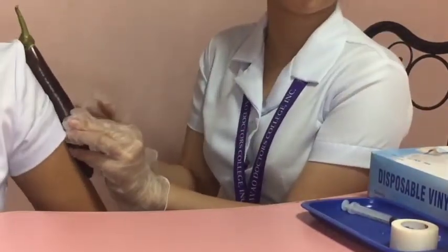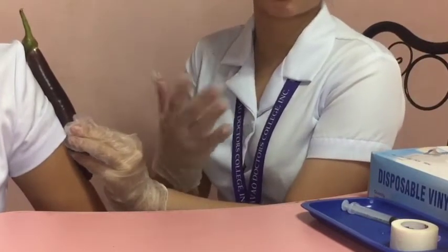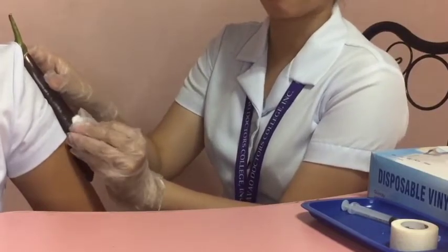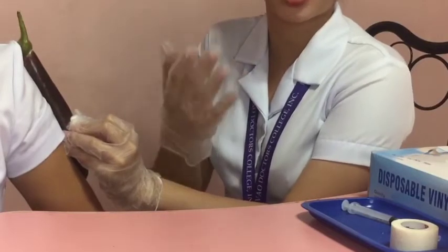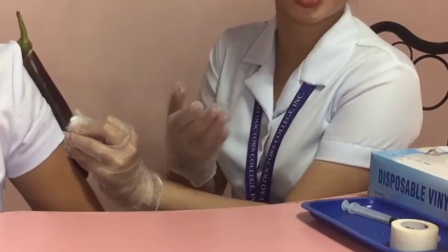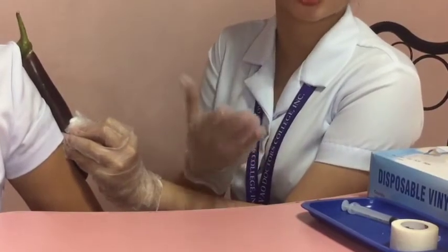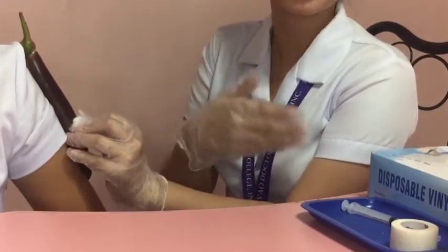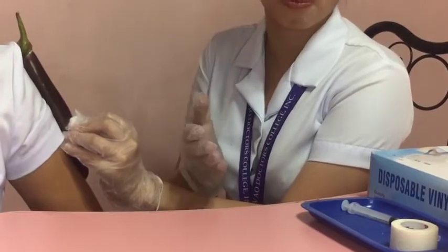After withdrawing the needle smoothly, which minimizes tissue injury, apply gentle pressure at the site with a dry cotton ball. Using an alcohol swab may cause pain or a burning sensation. It is not necessary to massage the area at the site of injection, as massaging may cause leakage of the medication. If bleeding occurs, apply pressure with a dry sterile gauze until it has stopped.